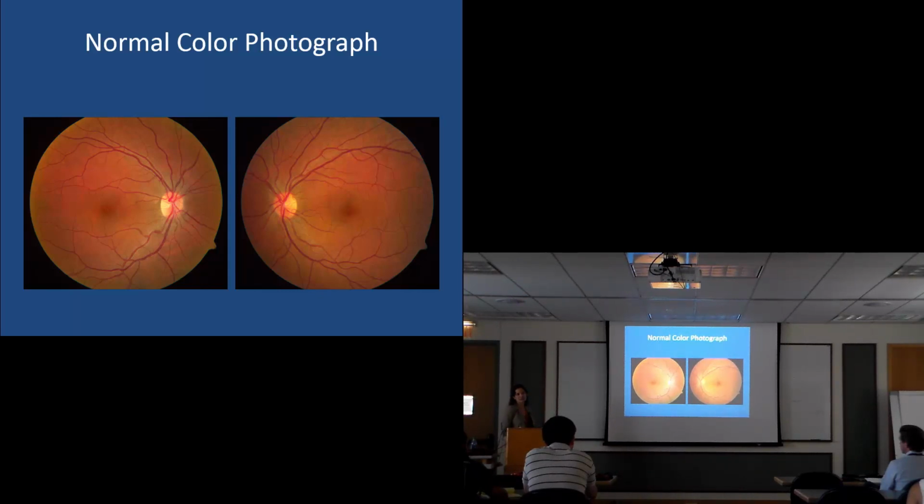A two-dimensional picture. If patients have retinal problems, which is basically all of the orange background here is the retina. The optic nerve comes up through the back of the eye and inserts here, and the optic nerve fibers go around in different striations, take the signal that comes in through the lens and transmit it to the optic nerve, with arteries and veins that traverse through the retina. In general, it's interesting to compare this to how animals' eyes develop, and in our eyes, we're almost at a disadvantage because our neurosensory retina that takes the picture is on the surface, and all of that information has to get down to the photoreceptors, and we'll see how that works.